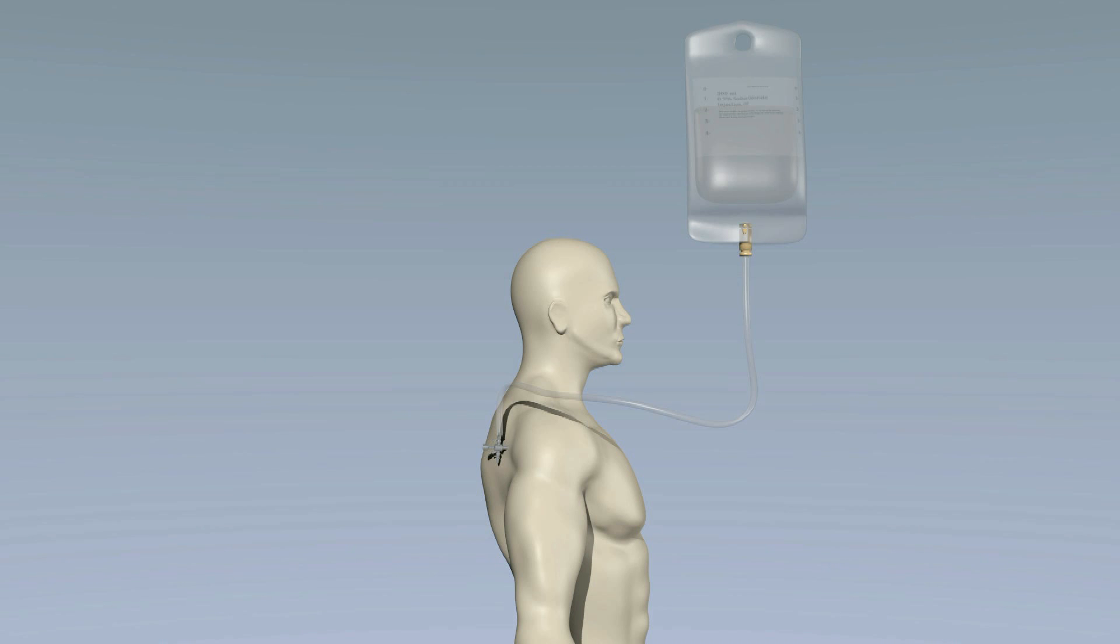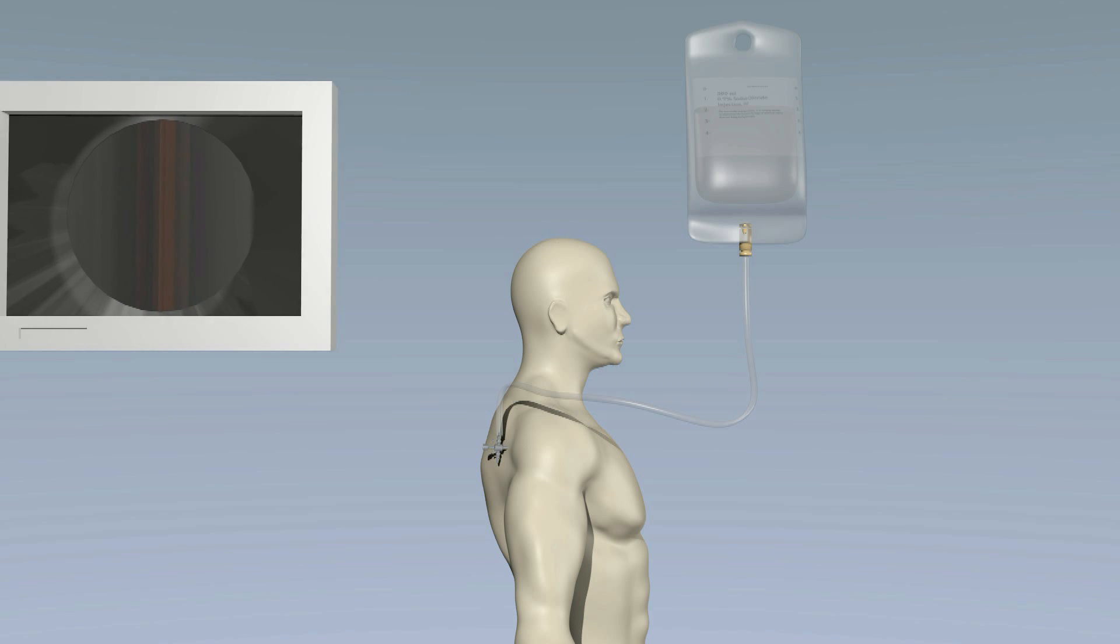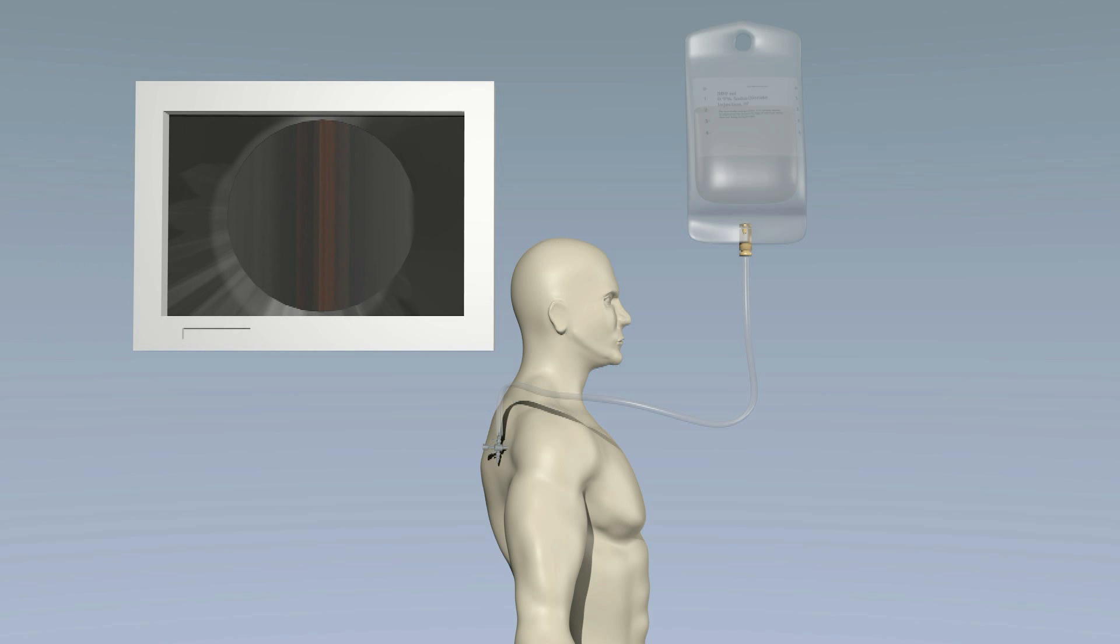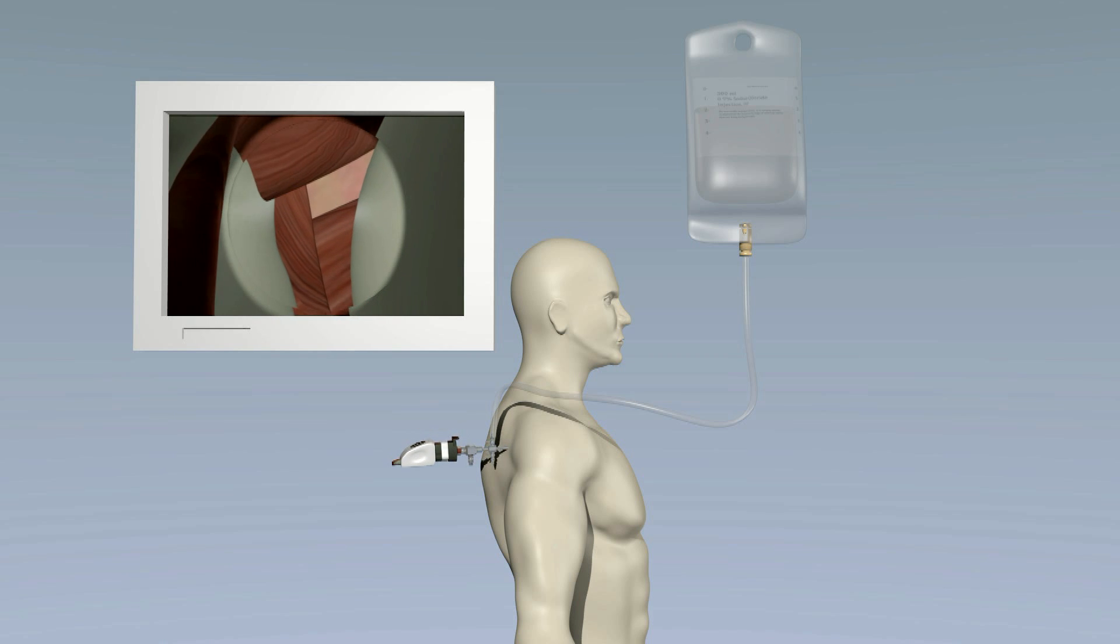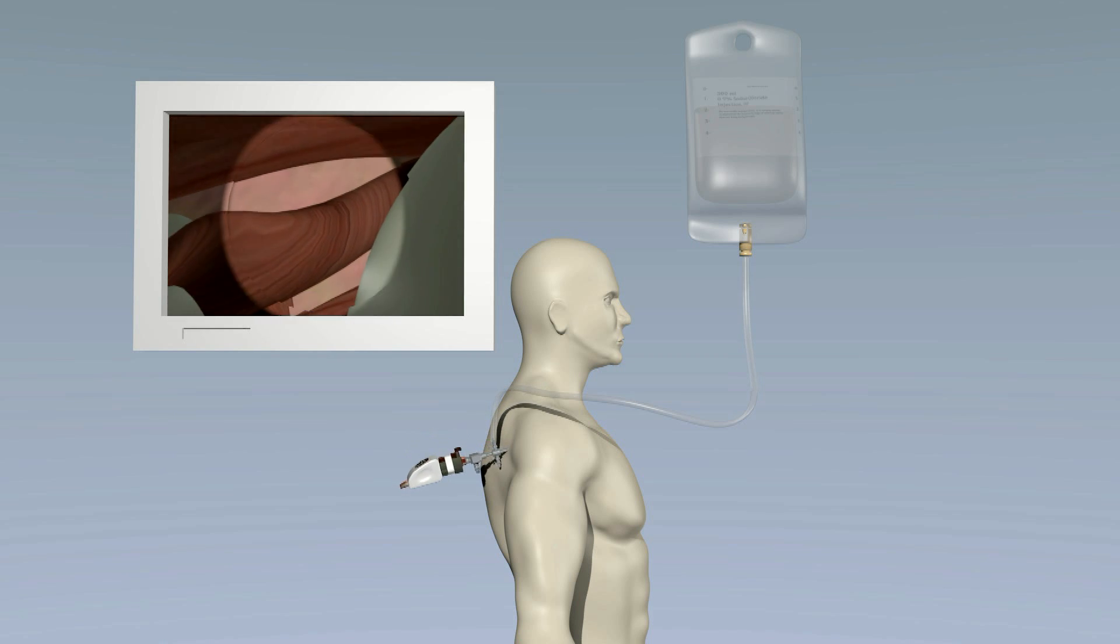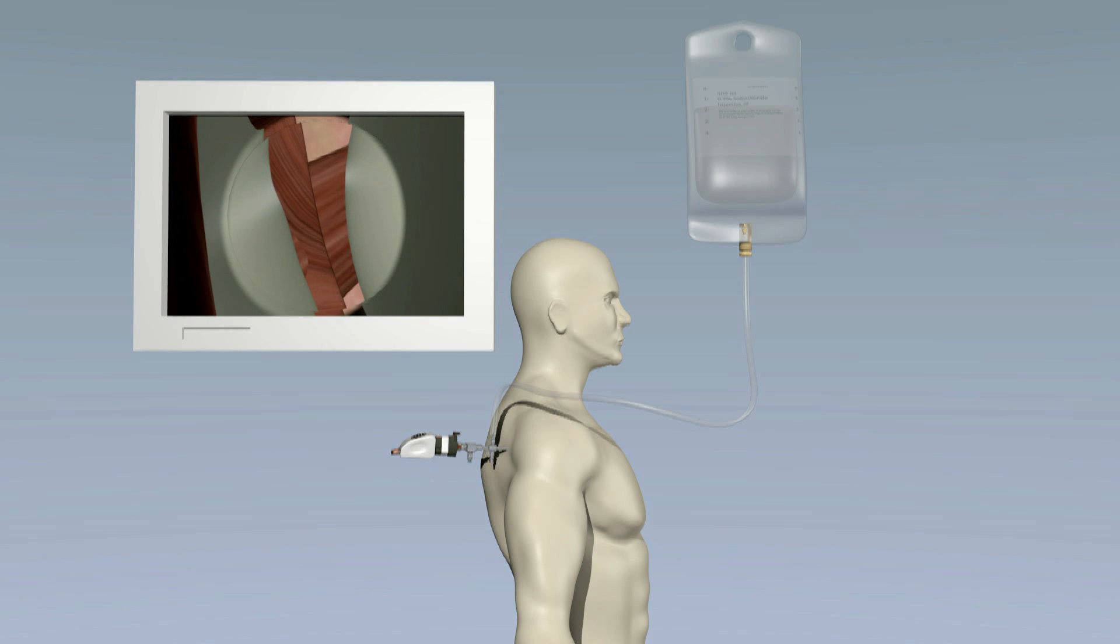This portal also allows for insertion of the camera. The camera is long and slender which makes it easy to fit through the portal. Fiber optic cables carry the signal from the camera to a monitor. The surgical team can then view the inside of the shoulder joint on the screen.